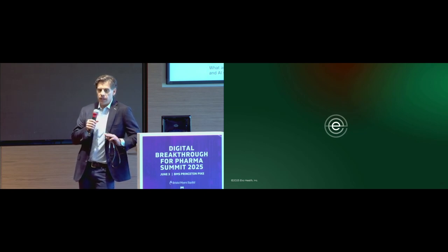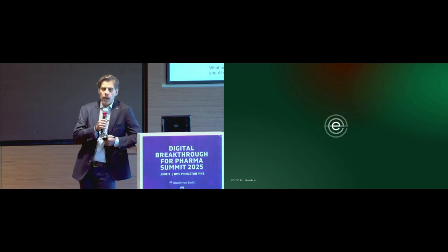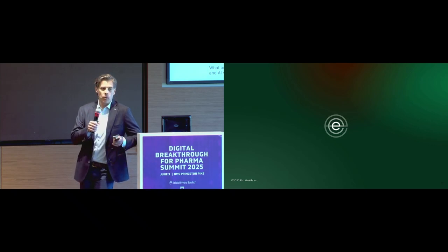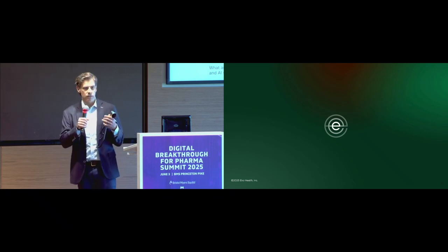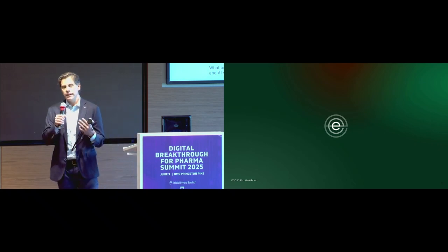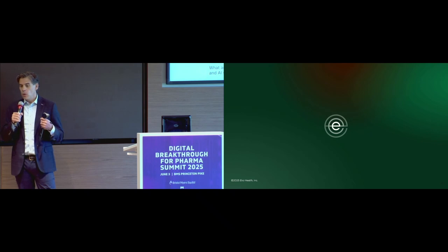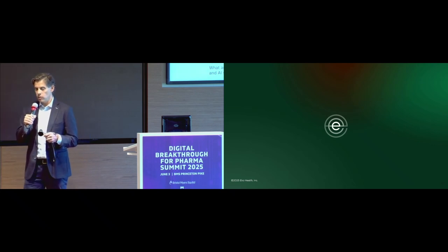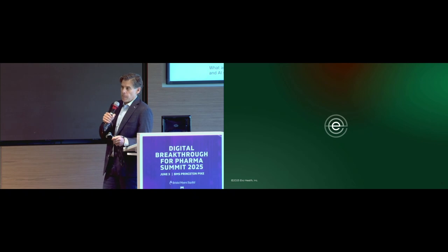Yeah, so when you can put a stethoscope in the hands of clinicians and they can use it in every exam, you can imagine that you get a lot of data very quickly. The really incredible leap that we've been able to make over the last couple of years is use what's referred to as a transformer model to train algorithms using this type of data that's not annotated, right? So we're collecting data, heart and lung sounds, but generally speaking, we're not getting the annotation alongside with it. Historically, that's had limited value in terms of new algorithms, but with transformer models, which uses the same kind of underlying technology as an LLM, we're now able to tap into that to be able to improve or magnify, I should say, the impact of the specific data that we're collecting that is annotated. So in fact, it's represented in our latest FDA submission, this new approach, and it's really unlocking a whole new approach to how we build our AI.